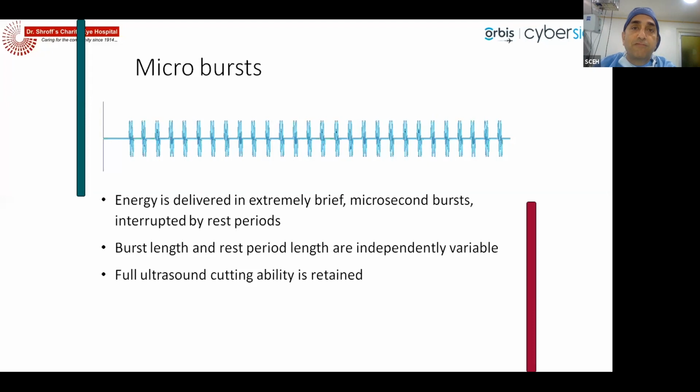The pieces will be flying because of the power, and the vacuum would want it to come to the tip, so there will be a lot of chatter. So the off times allow the piece to come to the tip after it's broken, so that the piece can be sucked in. So it's important when we are eating a piece, when we have to emulsify it after chopping, that you're in a pulse mode.